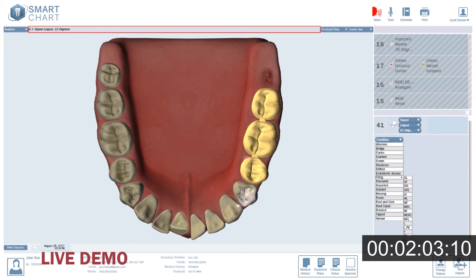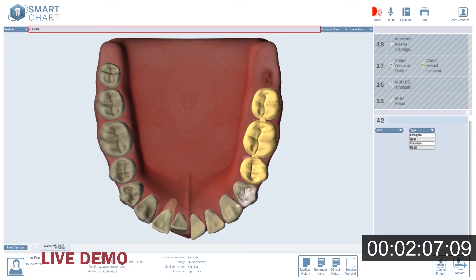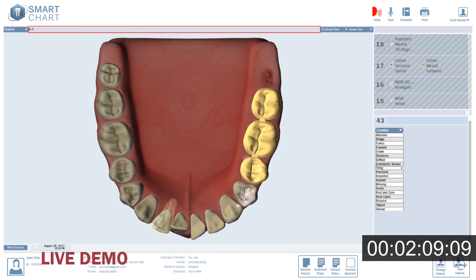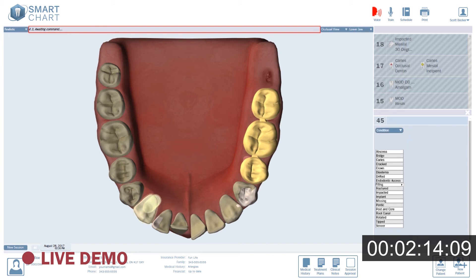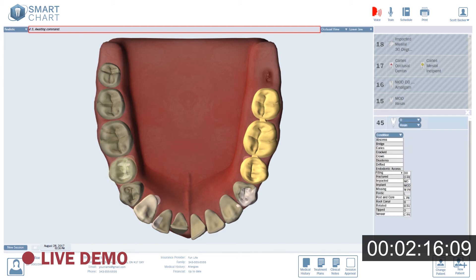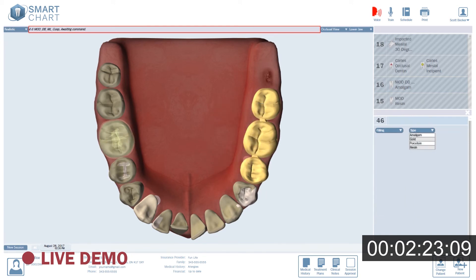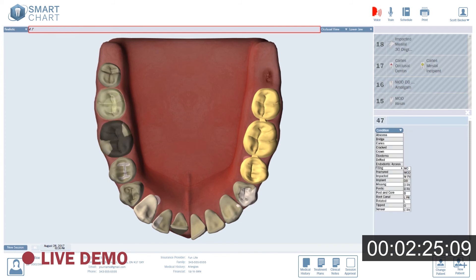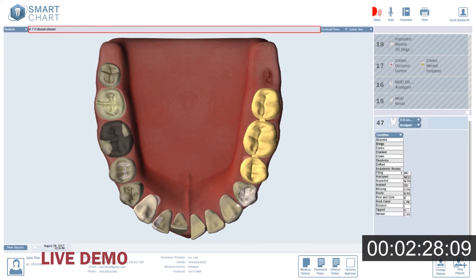4.2: DIFL, resin. 4.3: Implant crown, porcelain. 4.5: Occlusal, resin. 4.6: MOD, mesial lingual cusp, distal buccal cusp, amalgam. 4.7: Occlusal, buccal groove, amalgam. 4.8: Missing.